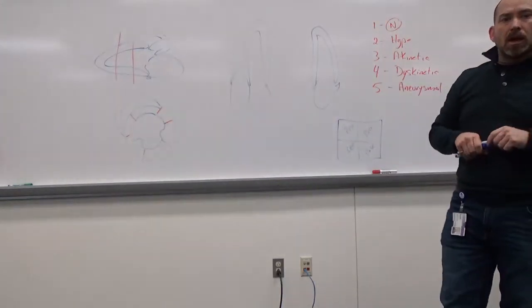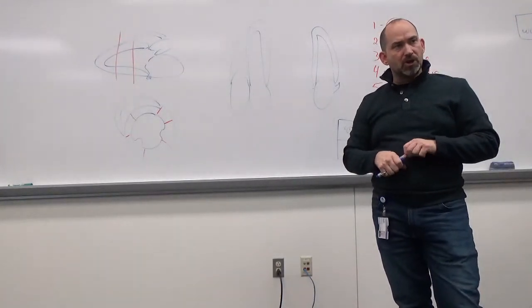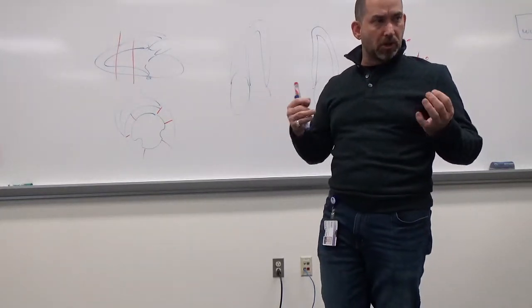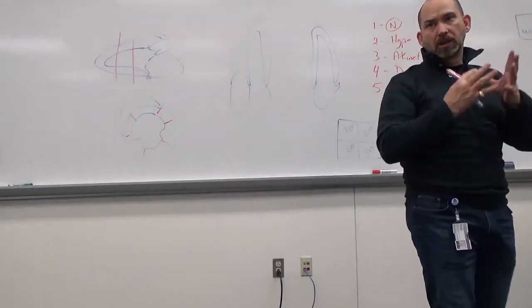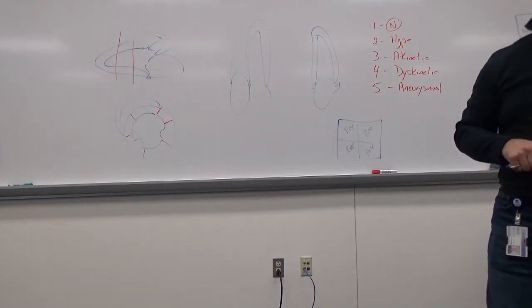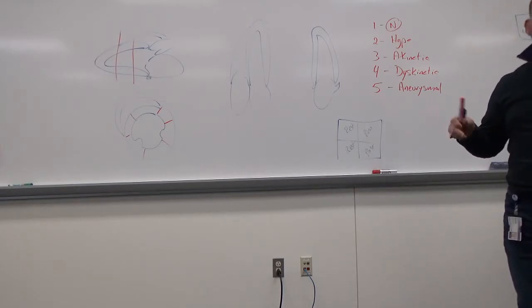Okay, the modality that's best at looking at perfusion imaging and looking at blood supply getting to tissue is nuclear medicine. They have radioisotopes that are tagged specific to the tissue type, and we're looking at blood supply getting into that. So nuclear medicine is better at perfusion than we are. But we do have the ability to look at it with contrast agents. Okay? You can't do it without contrast agents.